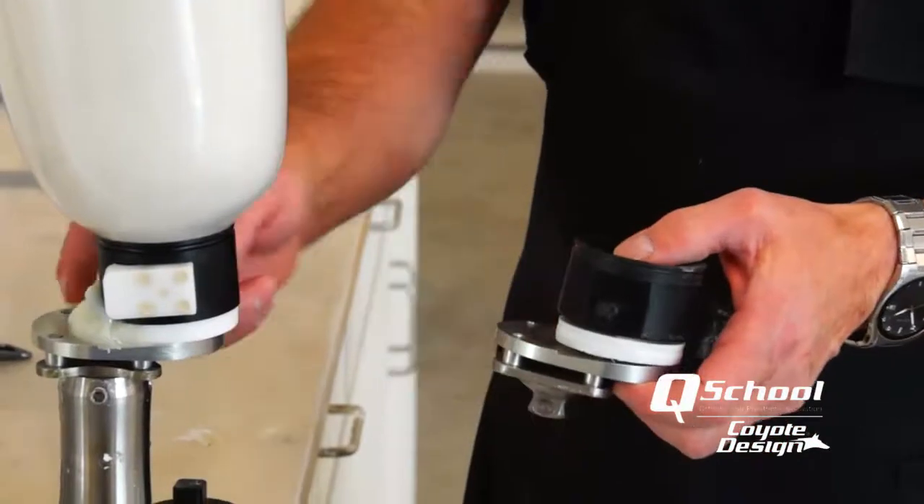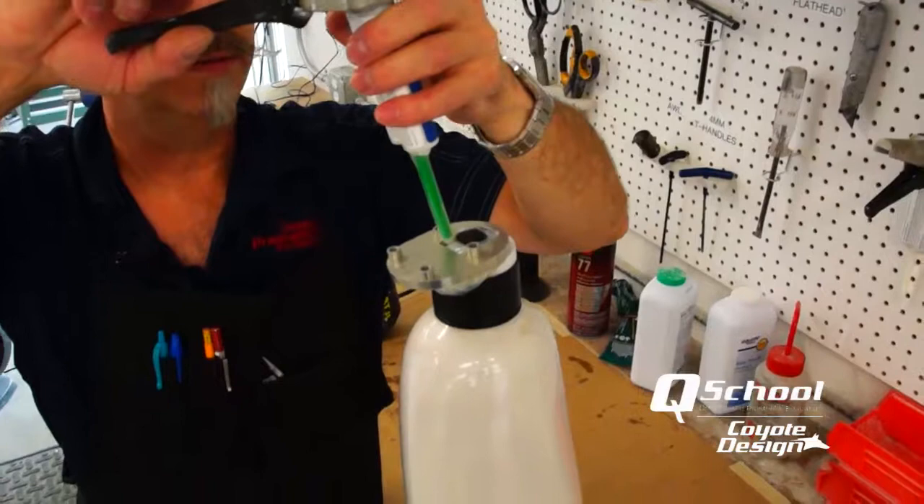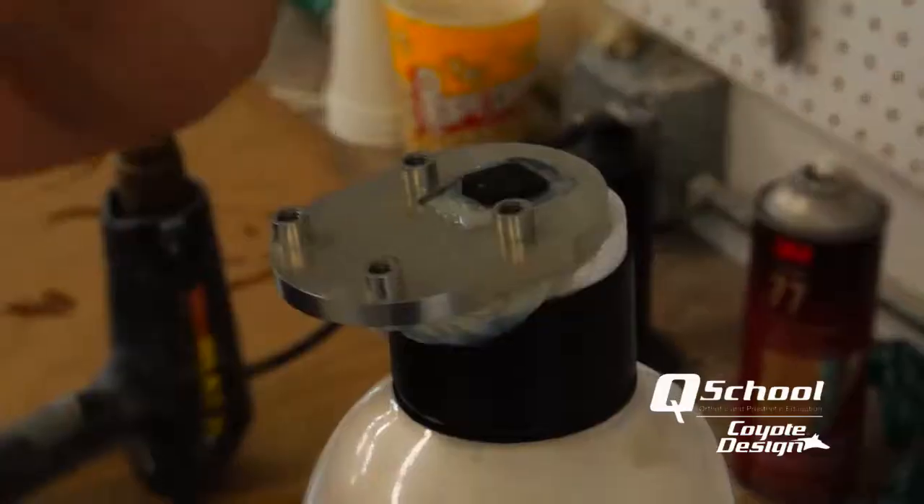When that sets up and is done, I'm going to flip it over, take my pyramid off, and then fill in any voiding that may be around the stem of my lock.